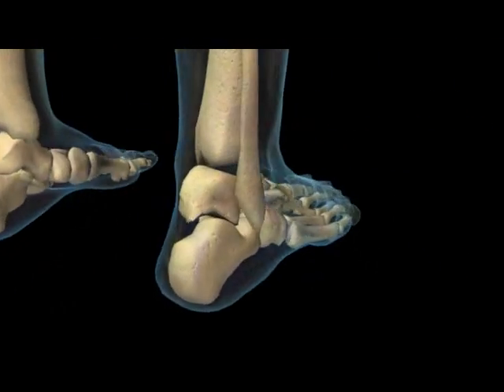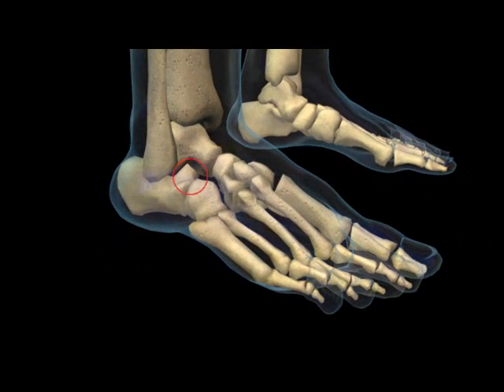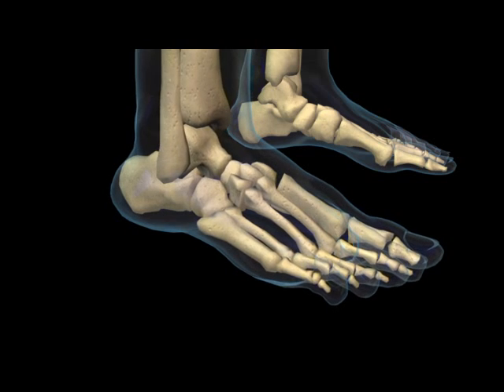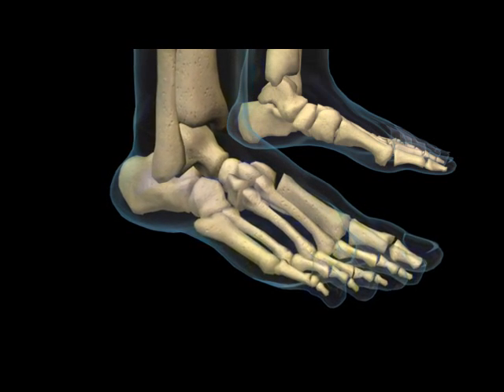The osseous alignment of the hind foot bones is crucial in order to maintain its function. Partial displacement of the talus, or ankle bone, on the hind foot bones or the tarsal mechanism is responsible for excessive hind foot motion or overpronation, which is also referred to as hyperpronation.